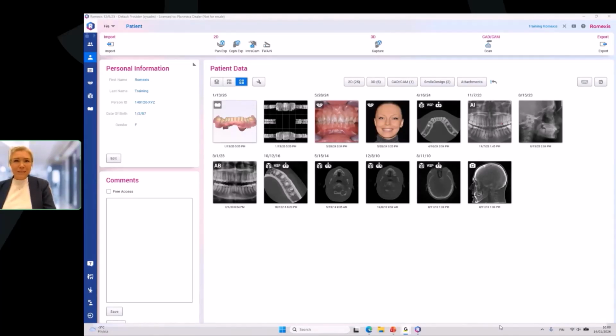I'm very happy to see so many of you there, almost 200, and it seems there's more and more coming all the time. So I hope you get some new skills that you can master in Romexis from this webinar. My name is Saila Parmes, and I work as the sales manager here at Planmeca for Romexis, and I will be telling you for the next hour about our 3D imaging module, about all the necessary and most important tools that you can start working with in Romexis.